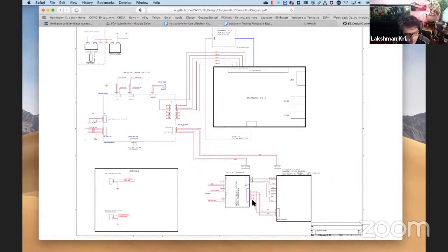Thank you, Randy. I want to take a small segue out of the design to talk a little bit about when we designed this, we wanted the system to be adaptable to other systems. And while our initial version focused on the AmbuBag, Jan and Randy also built a version that replaced the motor.